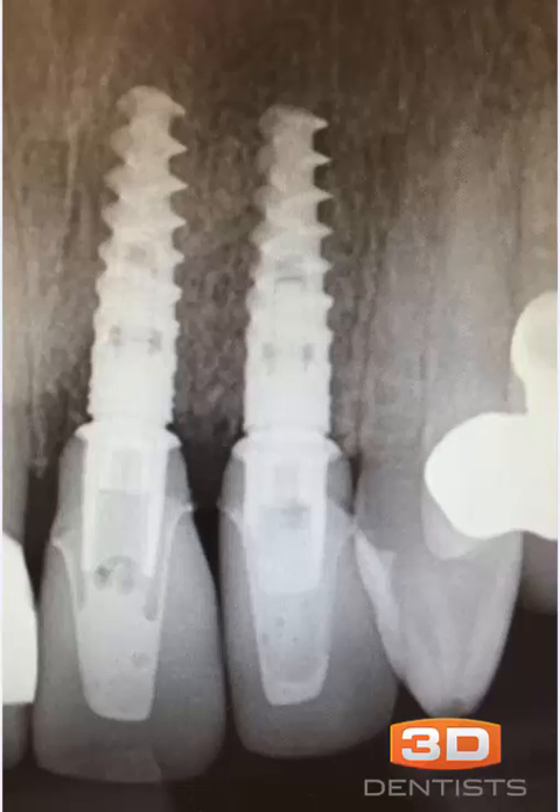What I'll do in red here is outline the head of the implant, just like so. There's the head of our implant. And then what I want us to look at in green is the width of our tie base shoulder itself. We can see that that width is actually wider than the head of the implant.